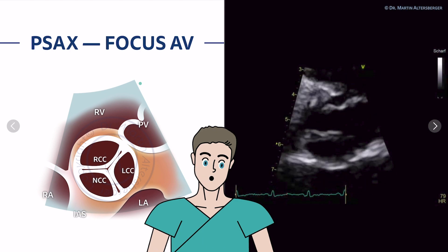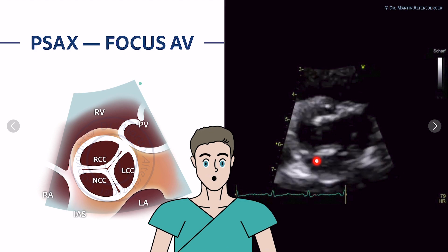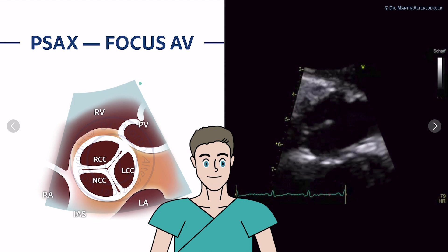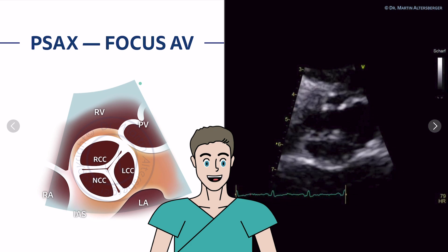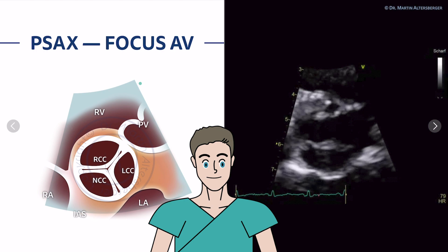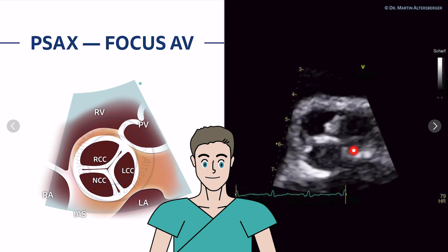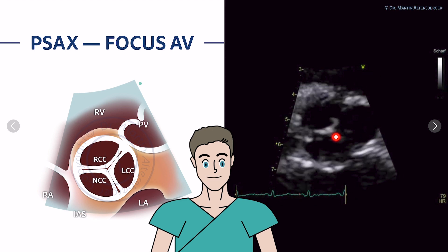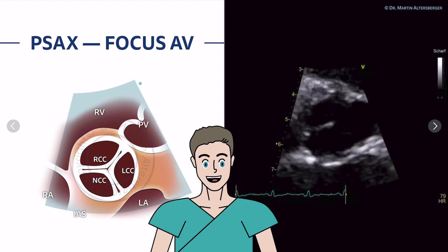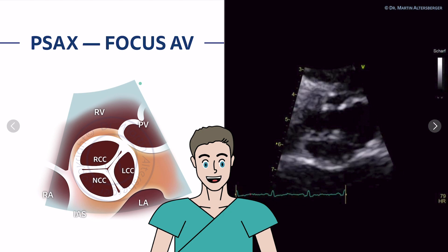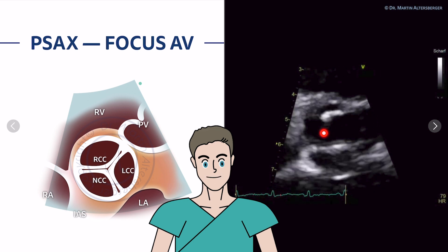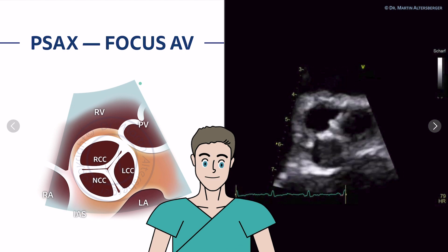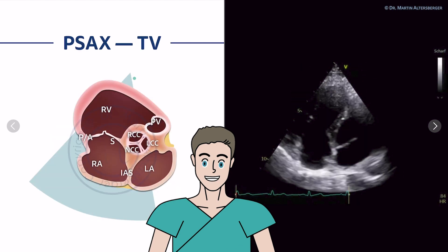The next view is a focused view of the aortic valve, where we zoom in — the same approach we use in the parasternal long axis view. In this focused view, we see that the aortic valve has three cusps and appears somewhat sclerotic or calcified, but there is no severe stenosis present, as the opening of the aortic valve is preserved. Always focus on the aortic valve in the parasternal short axis view as well.